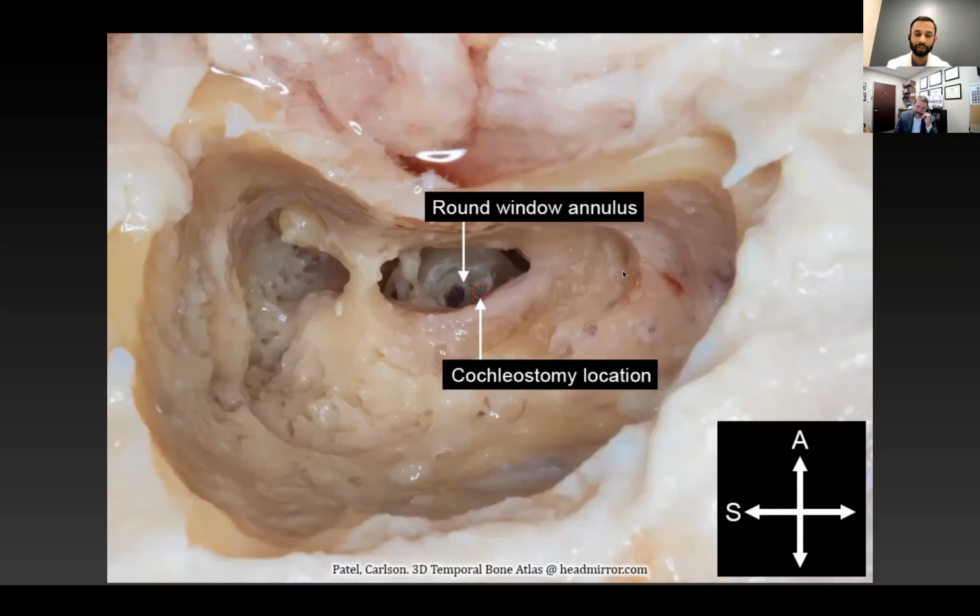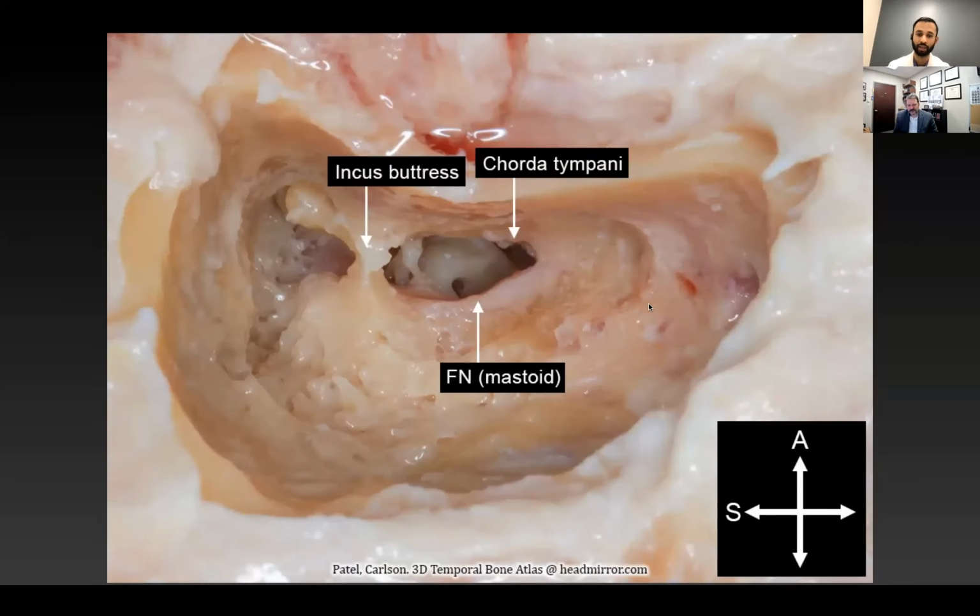I have a preference to see the chorda tympani nerve, and I'll go back just one slide. The reason for that is, especially when I'm working with trainees, I tell them I want to see the chorda tympani nerve, either in the bone, in the mid portion of the facial recess, or as it articulates with the facial nerve, not removing all the bone off the facial nerve.